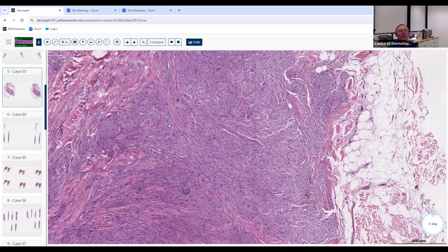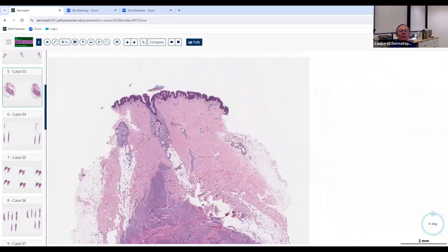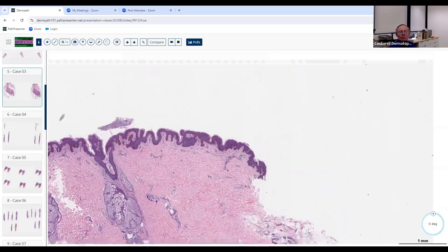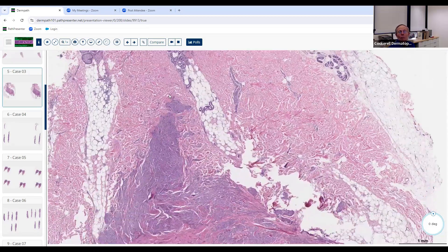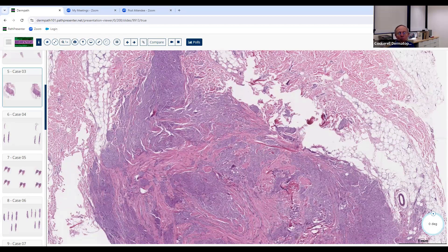It's interesting because it's so deep in the dermis. Granular cell tumors often occur more superficially and are associated with overlying epidermal hyperplasia — they can give pseudocarcinomatous hyperplasia. I've even seen the diagnosis missed, where a shave biopsy of a granular cell tumor hits only the epidermal changes and a few non-obvious granular cells and gets called squamous cell carcinoma. That's a real pitfall.